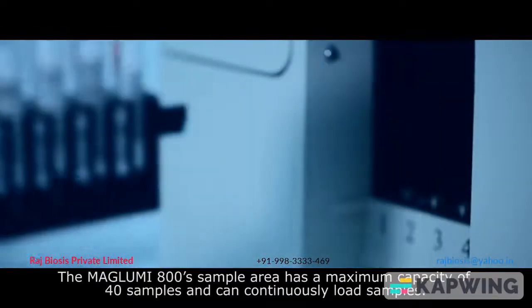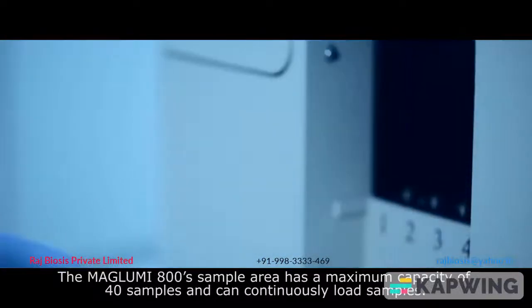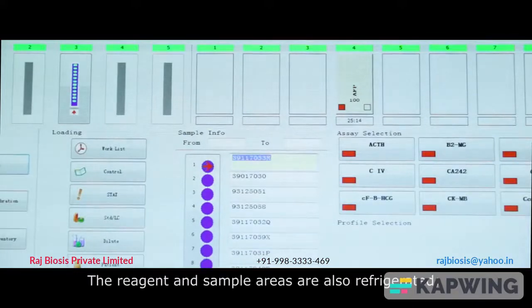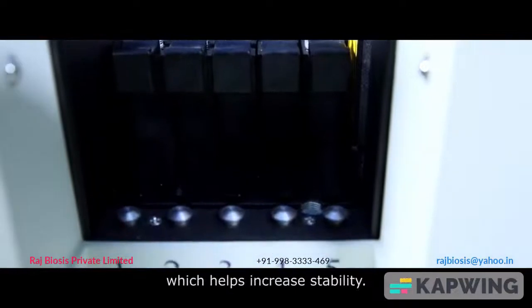The Maglumi 800 sample area has a maximum capacity of 40 samples and can continuously load samples. The reagent and sample areas are also refrigerated, which helps increase stability.